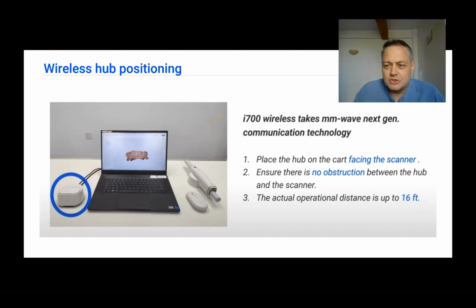and it's going to reduce that sound if your scanner is not getting any information, but it is not enough to know where you are and if you are doing the right thing while scanning. So please place your laptop so that it faces you while scanning, so you can watch what you are doing inside the mouth of the patient, but also what is happening on the screen.